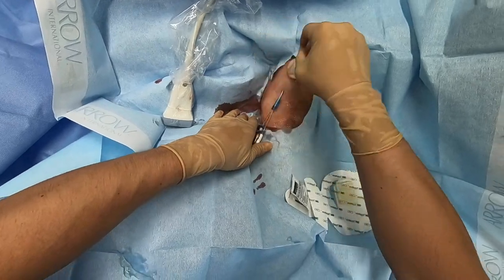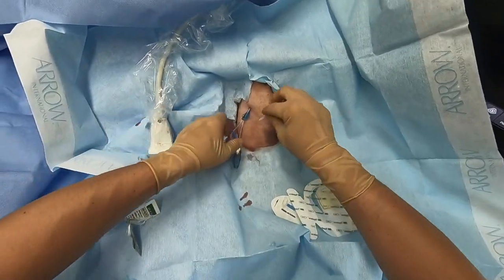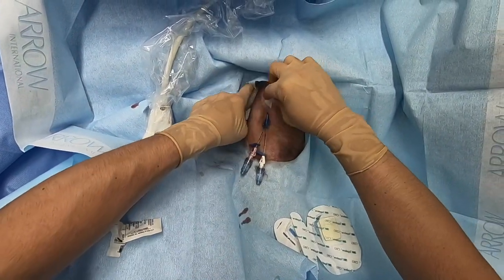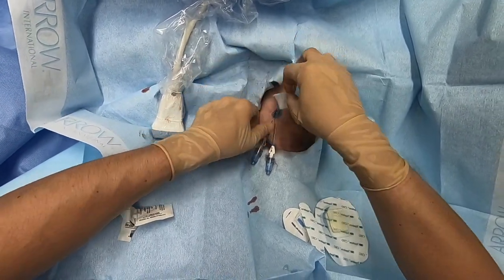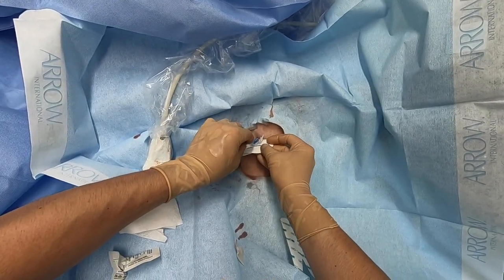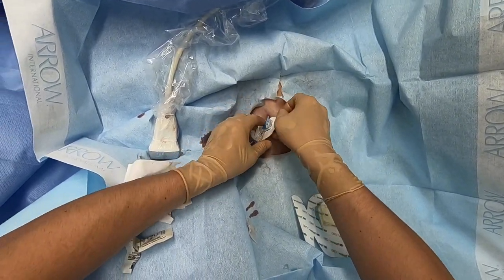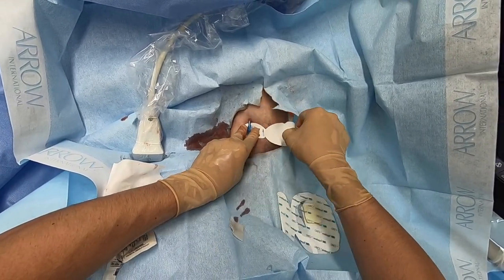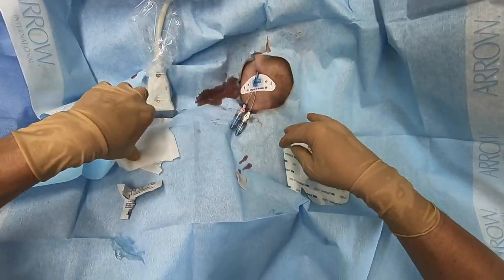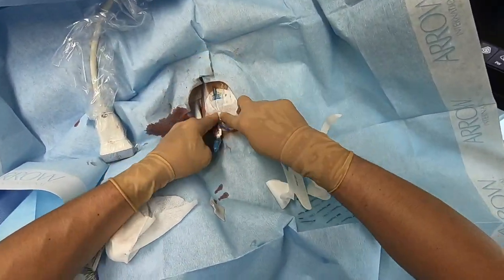Once we're done with pressure, we'll clean the whole area with chlorhexidine as always and let it dry, then get set to secure the device. This comes with a StatLock sutureless securing device, just like for PICCs — they're available for most catheters and I think it's always good to use. I would almost never suture these. It starts with a little bit of skin prep, which helps everything to stick, and then the StatLock. The arrows on this face toward the patient, it slips under the hub, and the little blue posts slide into the holes. You snap down the little doors, and then you can secure it to the patient by pulling out one and then the other of the adhesive wings. Make sure you secure it in the position you want it to remain, then dress it like any line. In this case, we're using the same chlorhexidine-impregnated dressings we use for central lines.